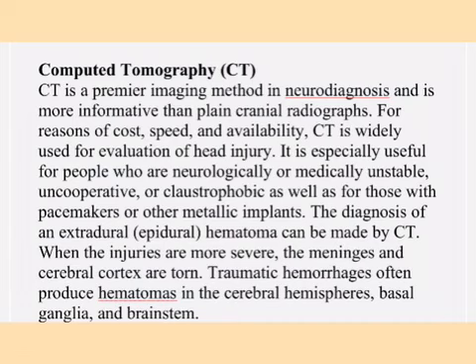CT is useful for people who are neurologically and medically unstable. People who are uncooperative also can be examined, and people who have pacemakers or other metallic implants also can be examined. The diagnosis of extradural, that's epidural, hematoma can be made by CT.